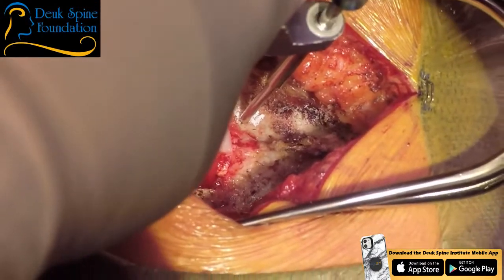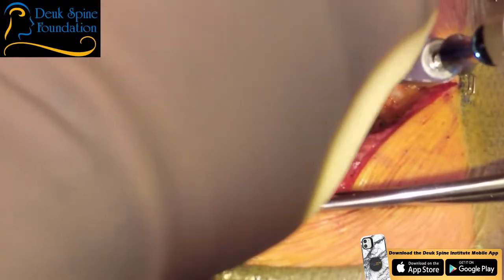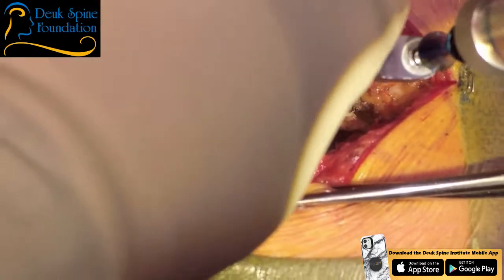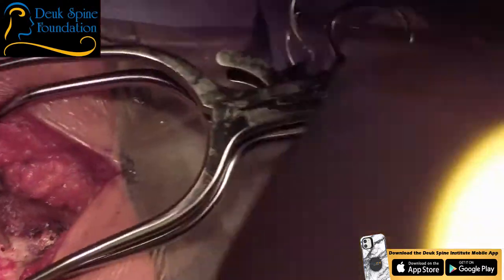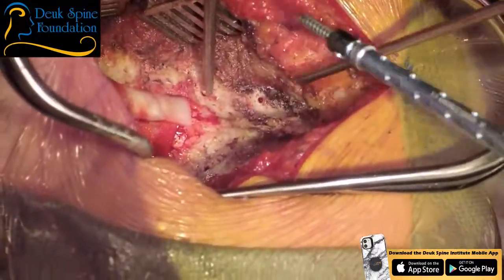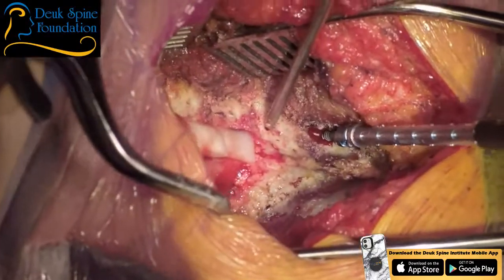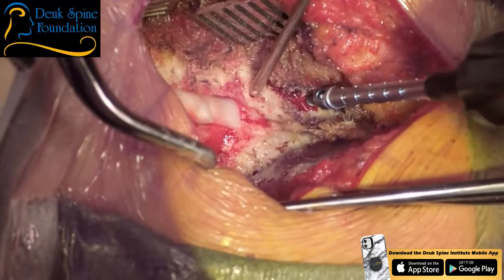All right. You can actually literally feel it crawl down the pedicle. And if you're going to err, you want to err lateral to the cord, no matter what. 16? 16. I always put 16 millimeter screws at T1 and T2. Remember, never point them towards the spinal cord, no matter what you do.